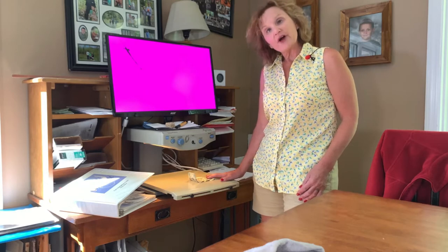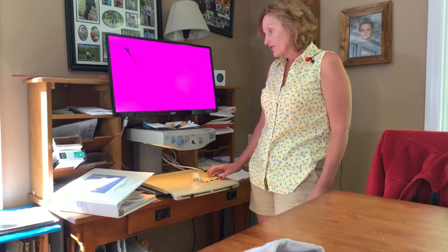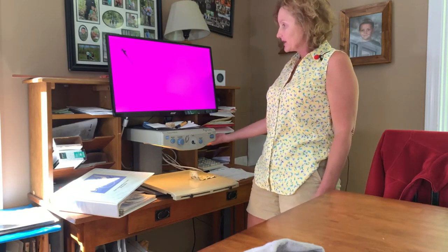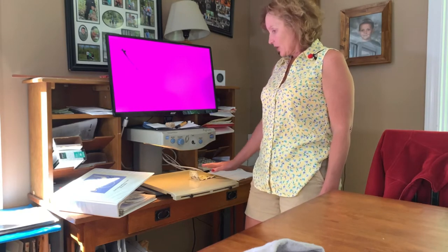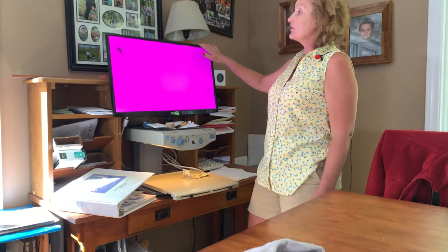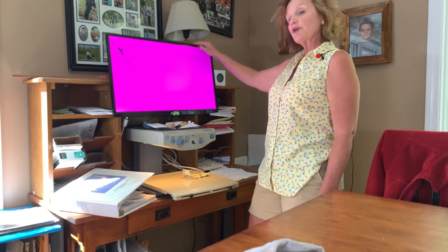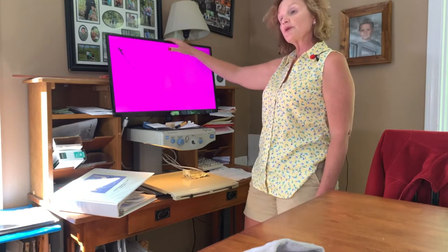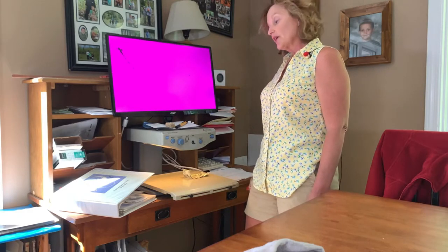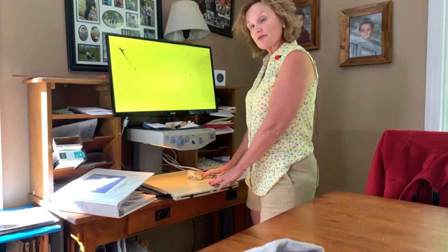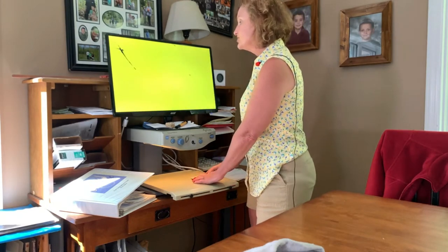Hi, this is Jen. Today I'm standing in front of a device called a CCTV, which stands for closed-circuit television, also called a video magnifier. It is a visual aid that has a camera inside which projects an image onto a tray called an XY tray. That image can then appear on a screen, an actual television, or a computer monitor.